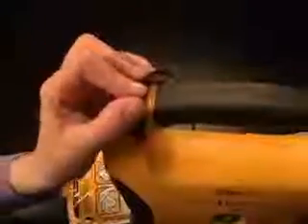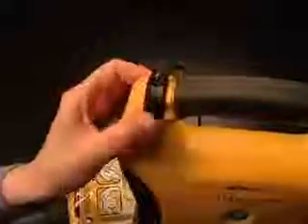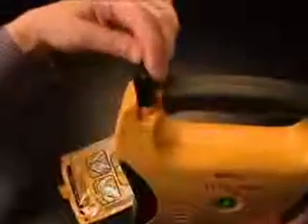To connect the pads to the AED, insert the connector into the slot in the upper corner of the unit. Note that the connector is designed to only go in one direction. Once connected, the pad package should be stored in the holder in the back of the unit. The pads should be stored so that the pad expiration date can easily be seen. Pads past their expiration date should be replaced as soon as possible. The pad cable should be pressed into the slot in the back of the AED.